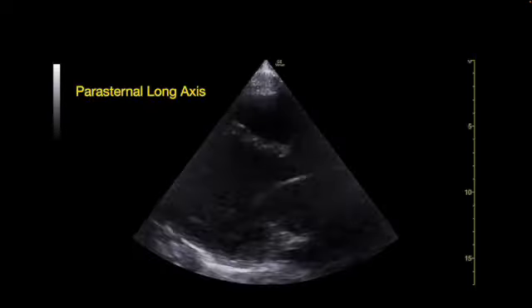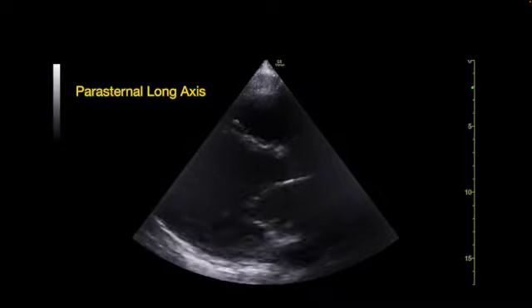What are you worried about in this patient? You're concerned that this is caused by an acute heart failure episode. So you know her lungs are wet, really wet, so you take a look at her heart. You want to know, is her ejection fraction now reduced? Because remember, she had heart failure with preserved ejection fraction.